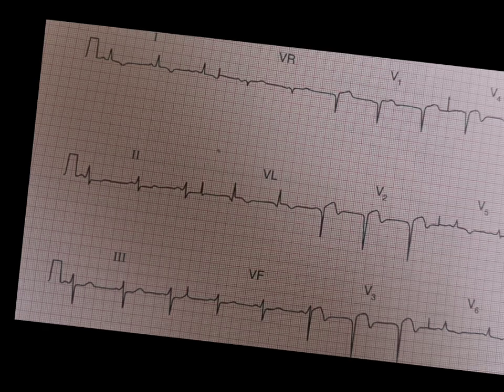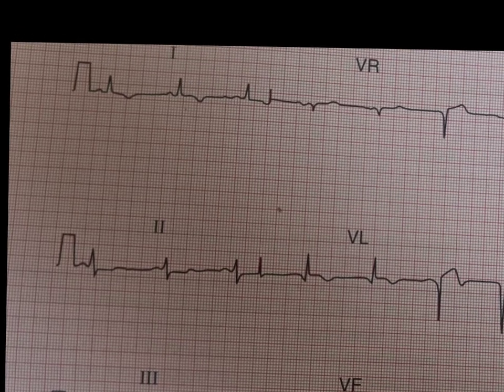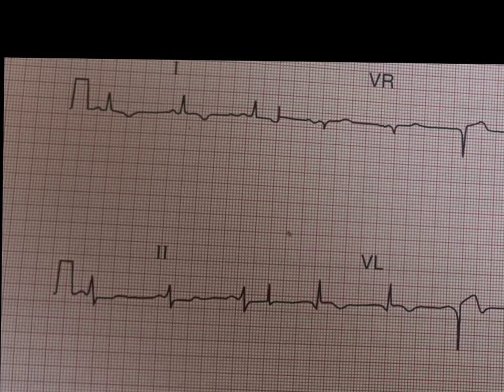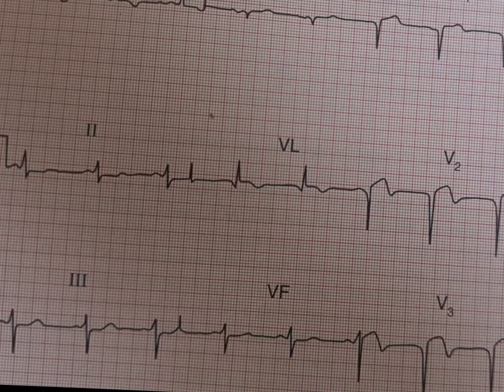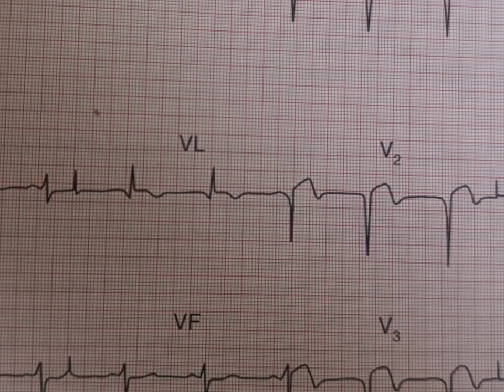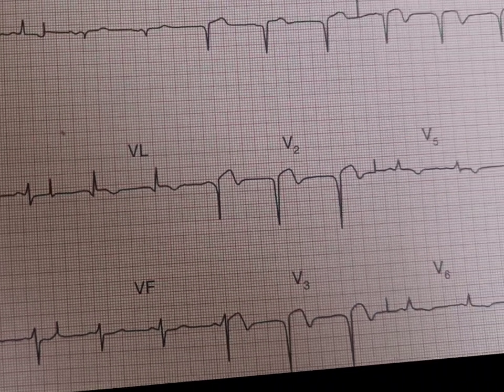In this ECG, in Lead I we have T wave inversions here. Then in AVL as well, we have T wave inversions.